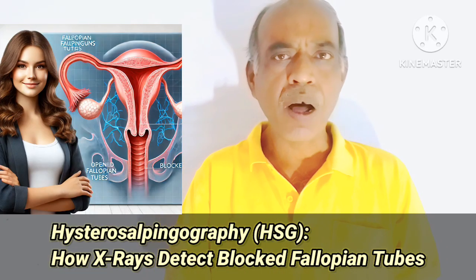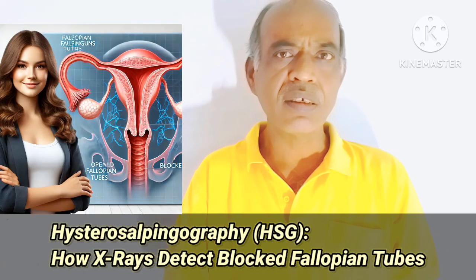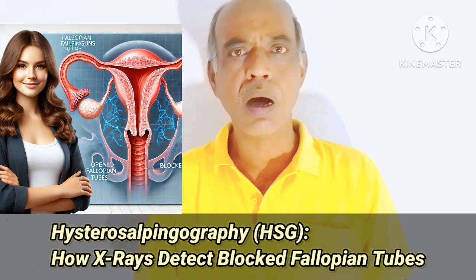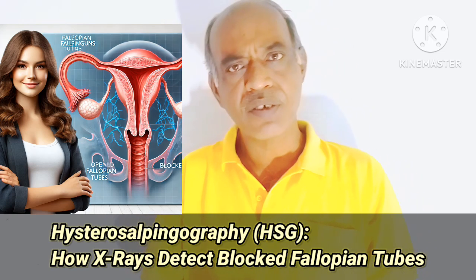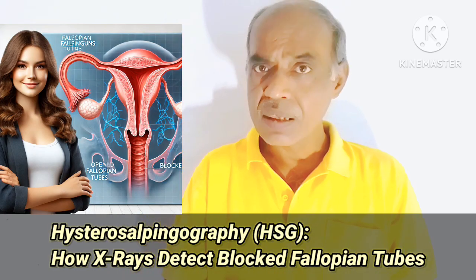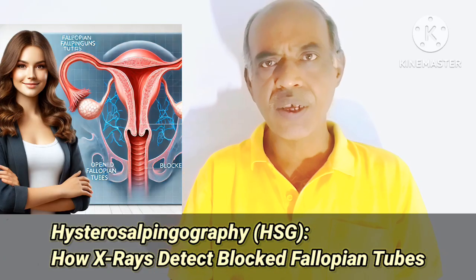When the dye passes from the uterus to the fallopian tubes, if there is any blockage, that can easily be detected on the image, because here real-time images are taken. This is a radio opaque dye, and that's why it is visible on the screen.